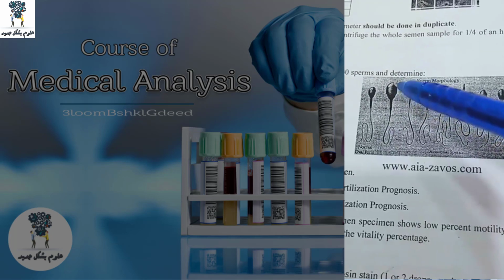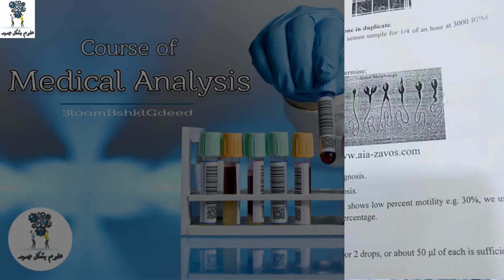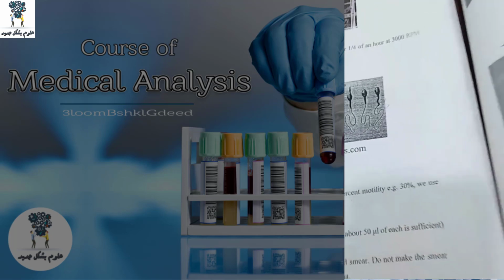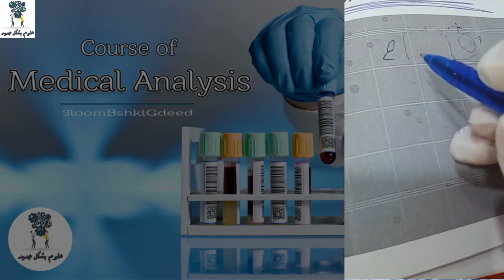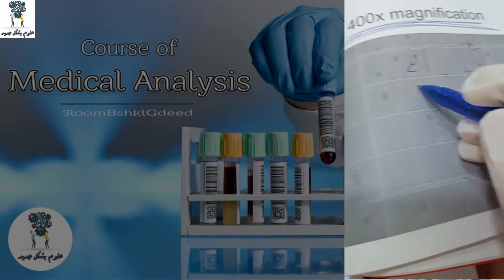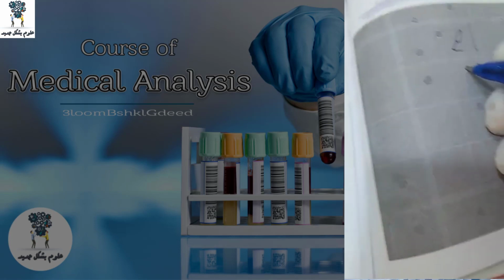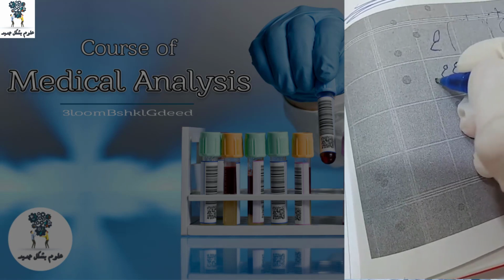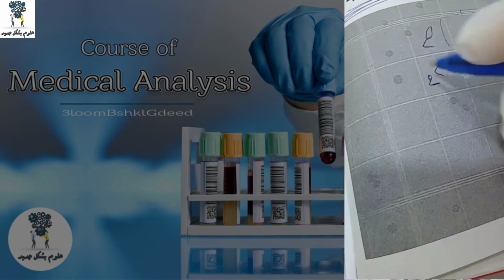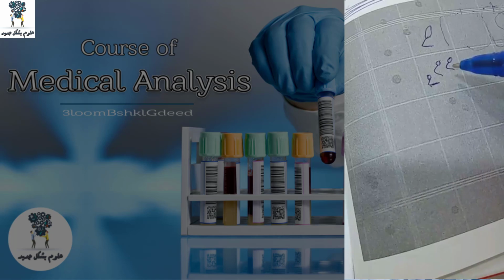So what will we do at this moment? We will identify and count normal heads and abnormal heads. Imagine that you have a sperm with a thin neck or a cut tail, or there are abnormalities in the shape.